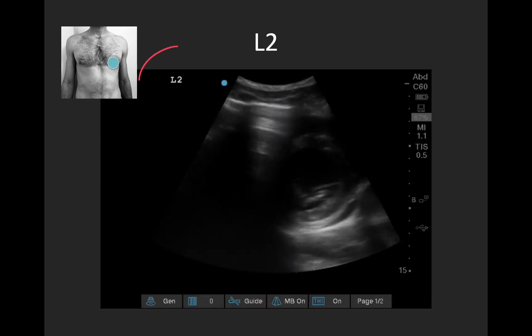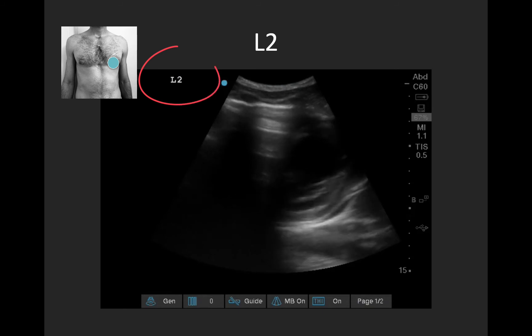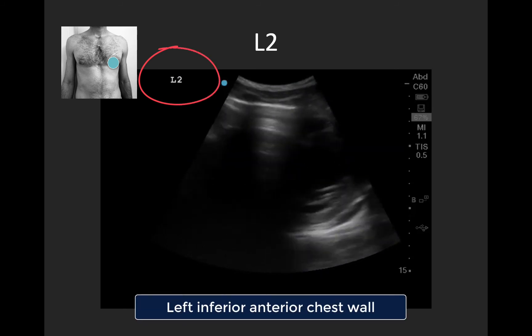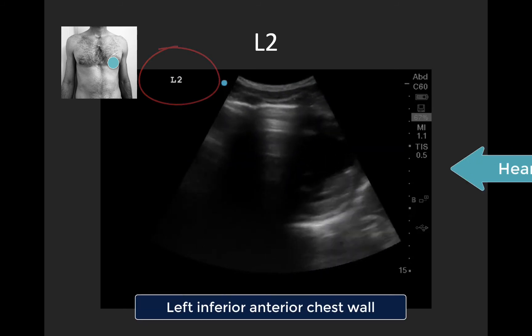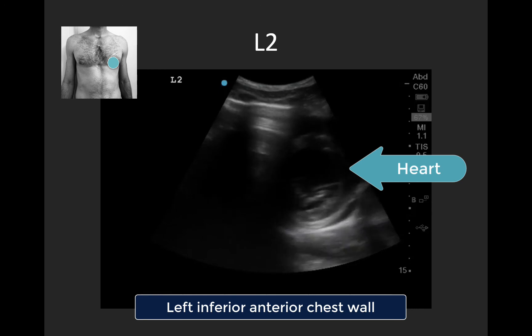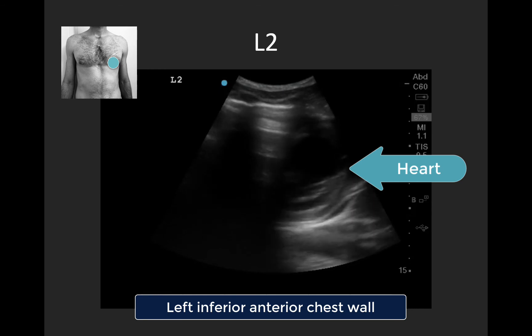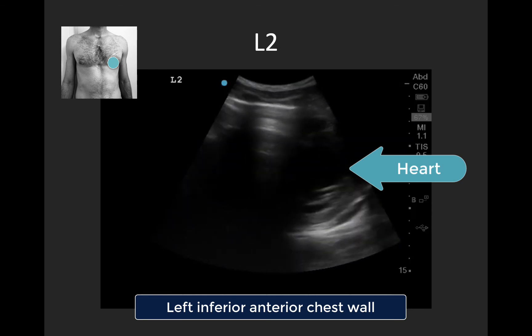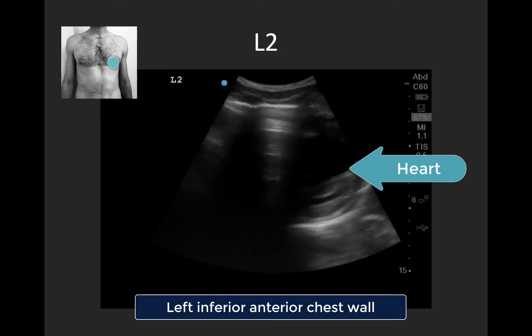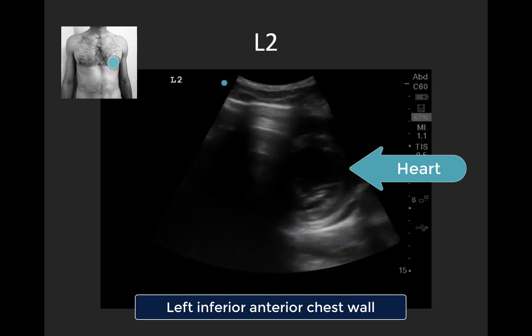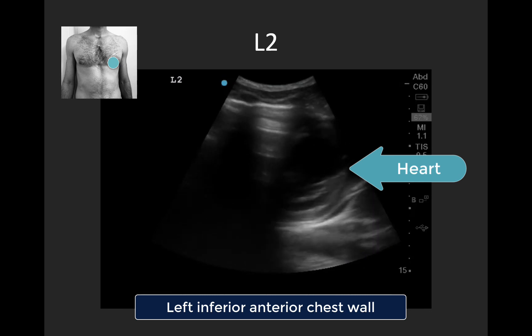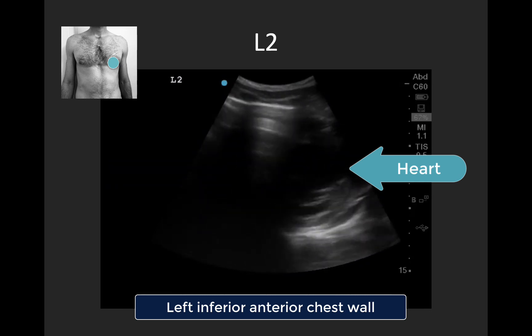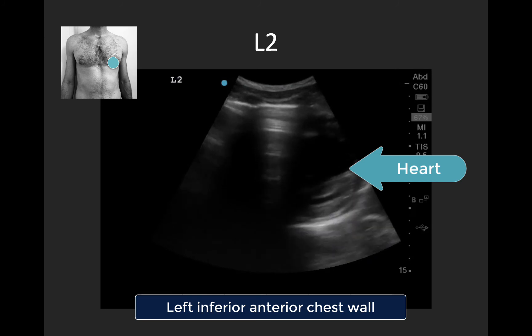Here we're in L2 — the left inferior anterior chest wall. You can see that on screen right, we have some heart getting in the way, which is very common in this view. In some patients you may not be able to maneuver a reasonable L2 view due to interference from the heart, so do your best but you will find in some patients this point isn't obtainable. Here we can see an A-line profile with a nice bright pleural line in the centered interspace.